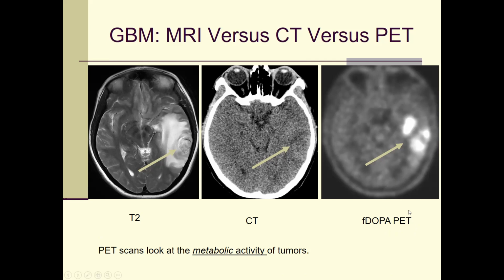So for the PET scan, you inject the tracer to be captured into the brain cells, and just wait for a couple of minutes to get to the scan. And then the PET scan is able to visualize the injected tracer engaging into those tissue abnormalities.